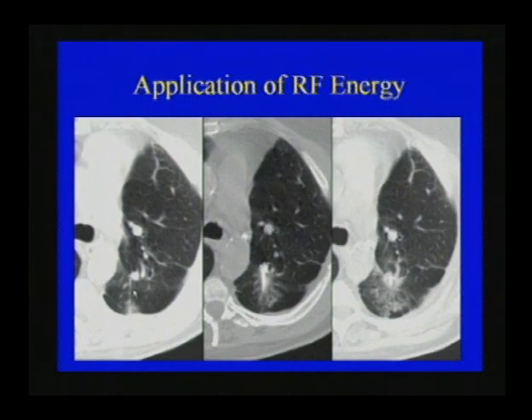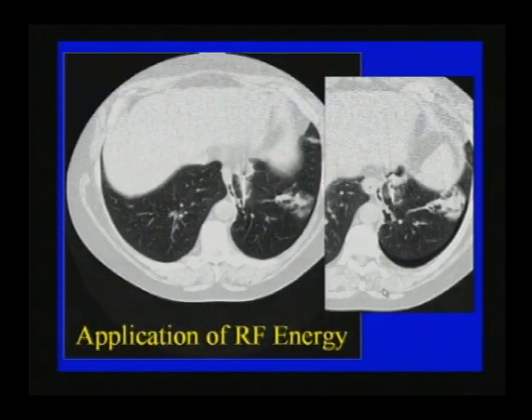So here you see the lesions we take on. We are taking on lesions that range in size from 8 to 10 millimeters through, as I mentioned, to 5 centimeters. And what's important is that you place the tines at the rim of the lesion and do your burn. And this is the ground glass halo that we like to see immediately post-procedure.